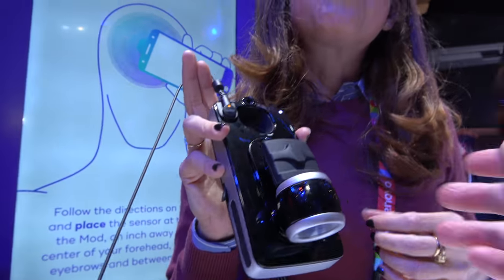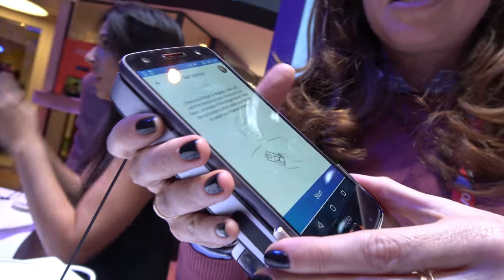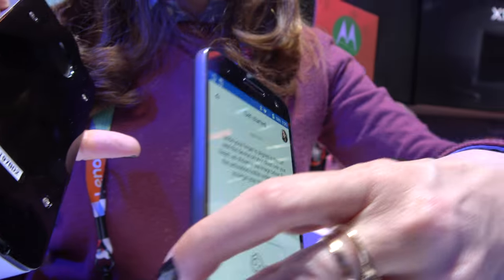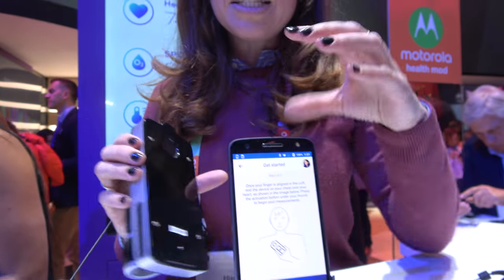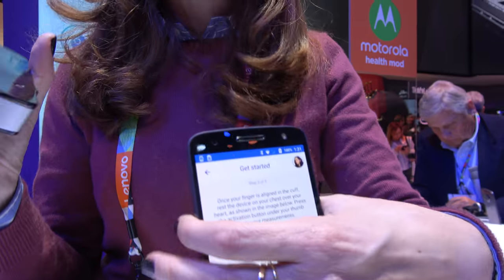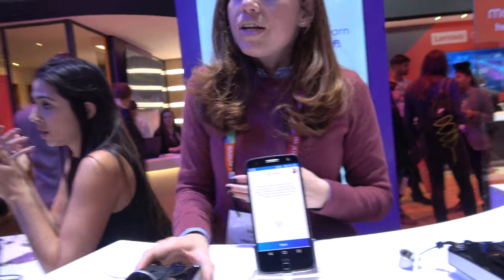This is a really cool mod. It goes on the back of the phone — it magnetically fits to the back of the phone just like this, but it operates via Bluetooth. Not unlike the traditional Moto Mods that connect through the pins; ours operates via Bluetooth. So you can put it somewhere else, like on a table, or on your heart. You can operate it both ways.